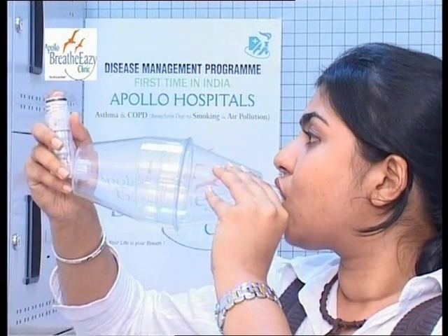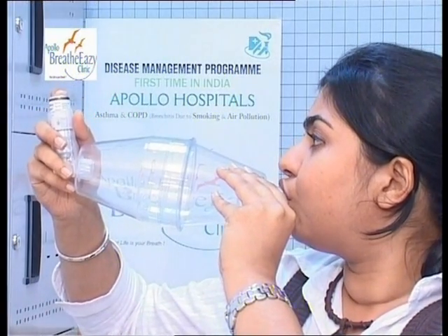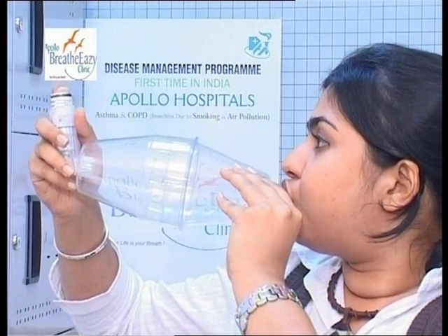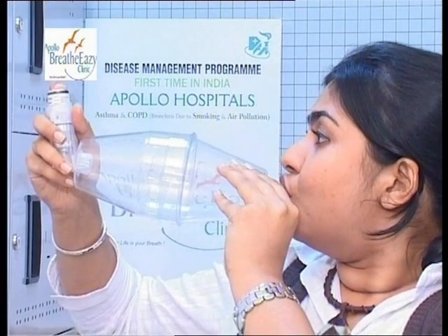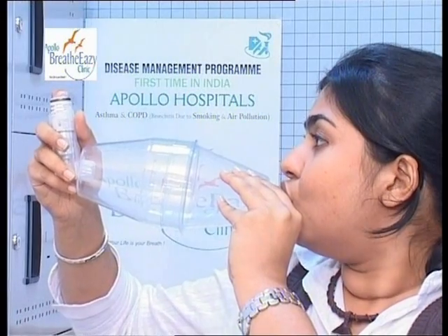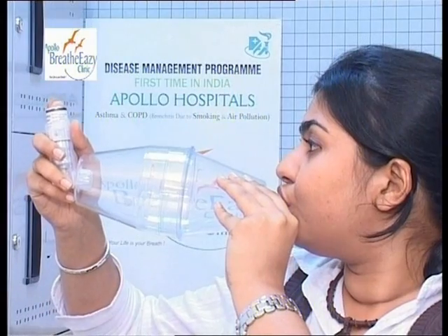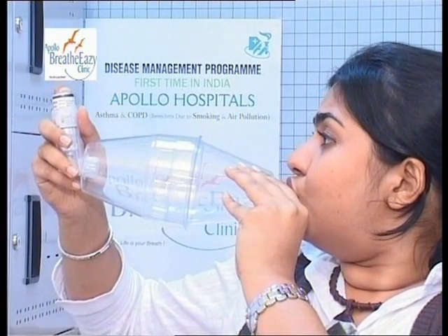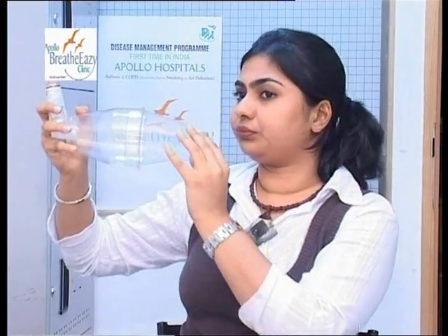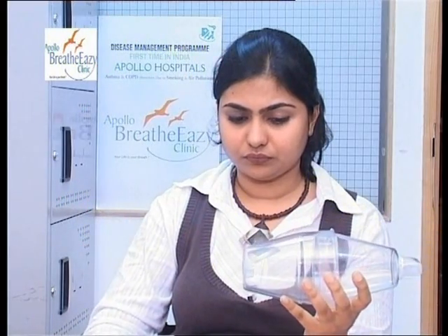Spray and inhale, then exhale into the spacer device. This is done five times. Air does not go back into the device — it leaves through tiny openings around the mouthpiece.